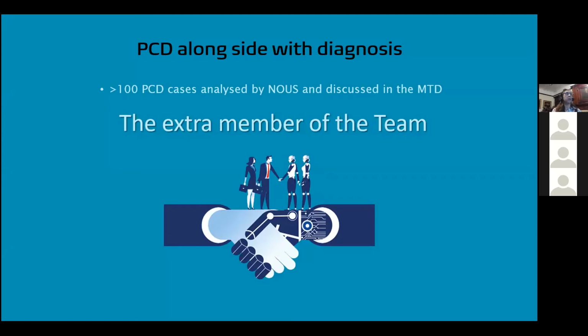We basically feed it our images. It will give us a result, and we can quickly scroll through the images and see if we agree or not. And this takes minutes against the hours that it might take with a normal diagnostic path. So it's an additional member of the team, and it gives us time to do other tasks and to focus on the PCD cases. Those are the ones that really need more attention, and we have time to focus on those and analyze them with extra care.